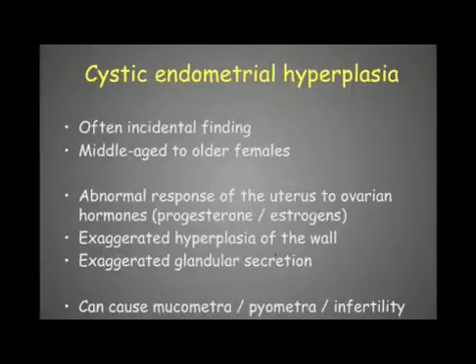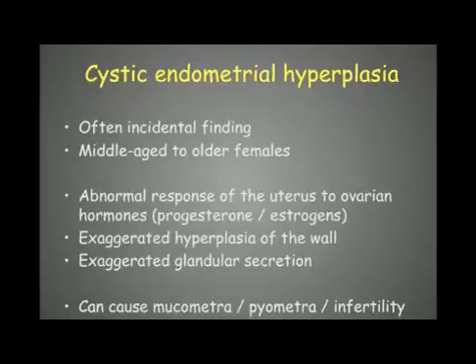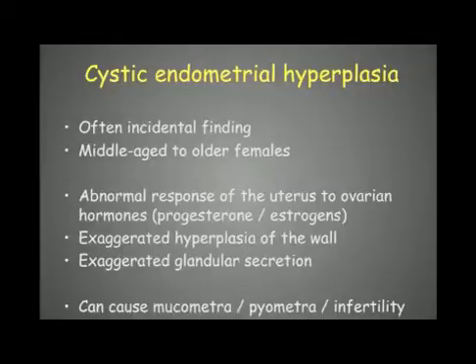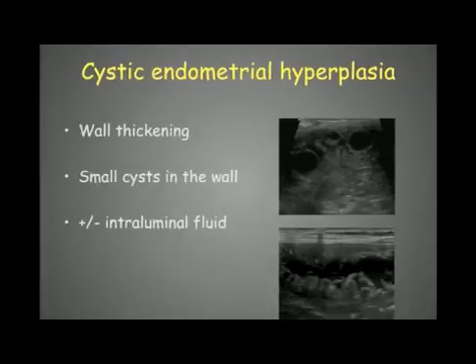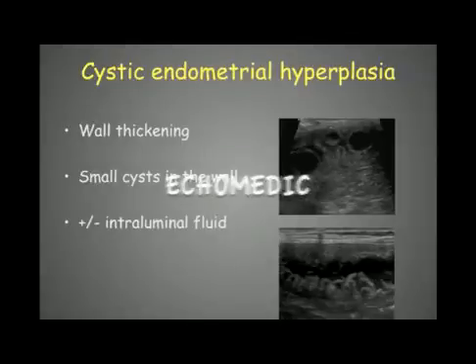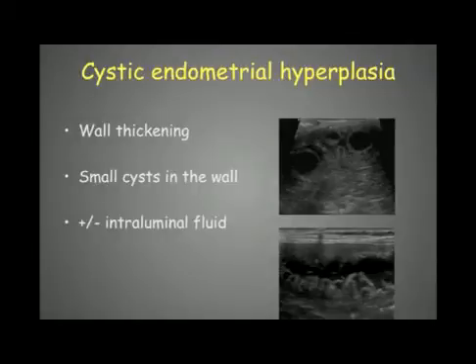The first pathology we can encounter is cystic endometrial hyperplasia (CEH), often an incidental finding in middle-aged to older female dogs. It is due to an abnormal response of the uterus to ovarian hormones, creating exaggerated hyperplasia of the wall with exaggerated glandular secretion. It can secondarily cause mucomitra, pyometra, and infertility. The typical ultrasonographic appearance is wall thickening with small cysts in the walls. Here we have two examples where the cysts are very large and clearly recognizable.